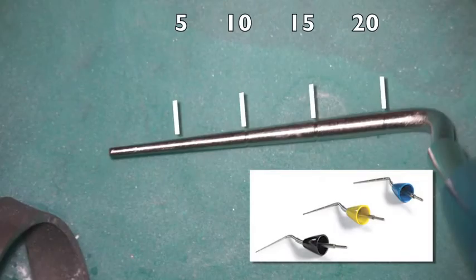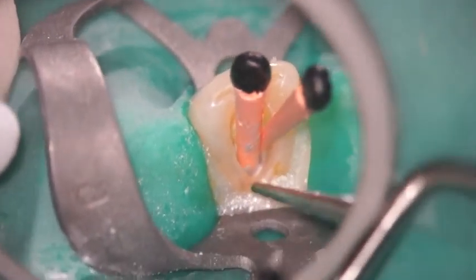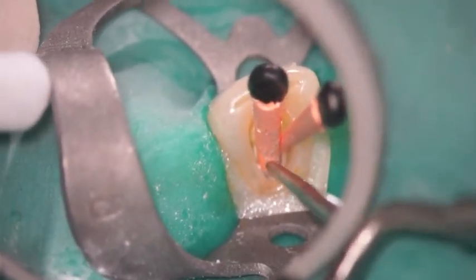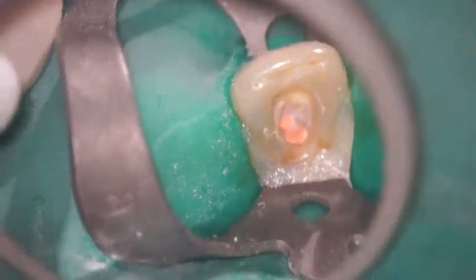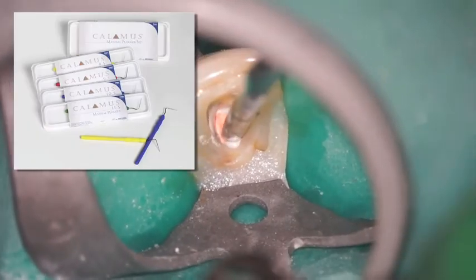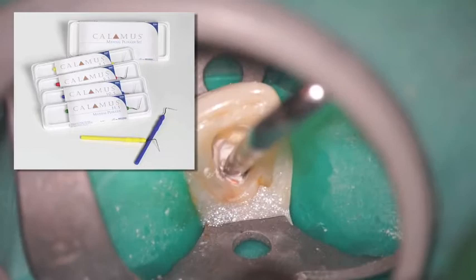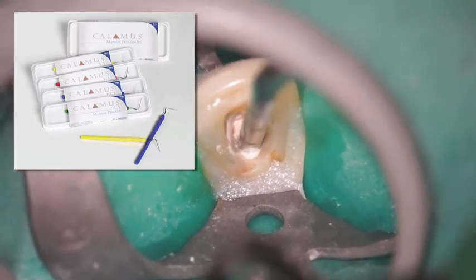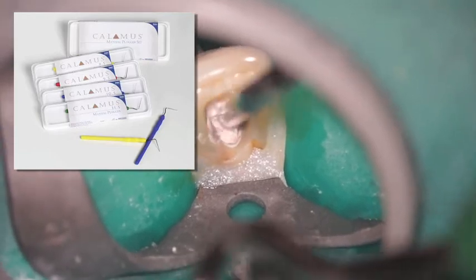Here's the Calamus heat tip and the plugger tip. I'm going to sear that right off at orifice level. Then I'm going to take a larger sized Calamus plugger and immediately capture that gutta percha and condense it vertically. Obviously, there's a little bit of sealer with it.